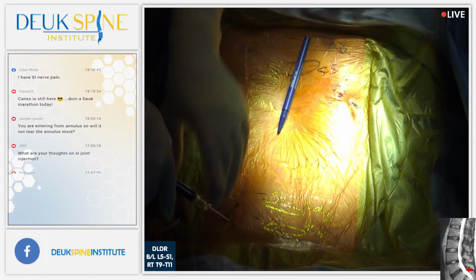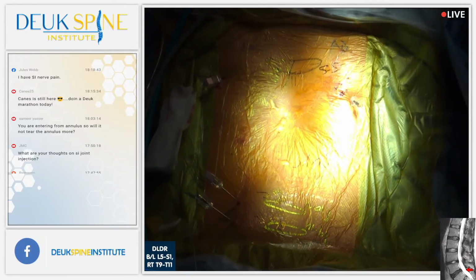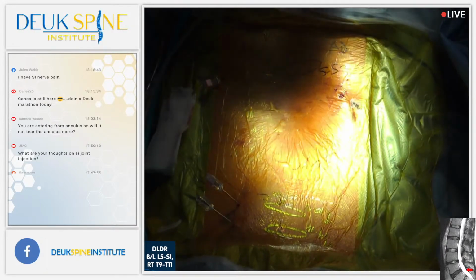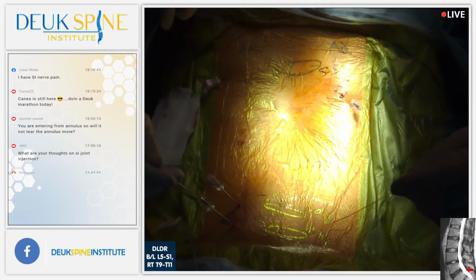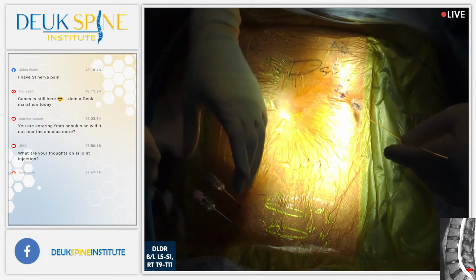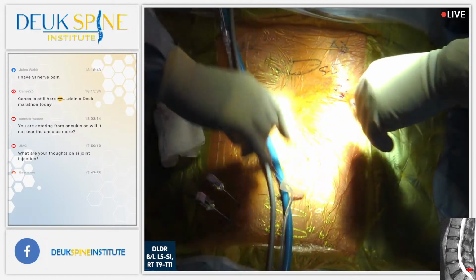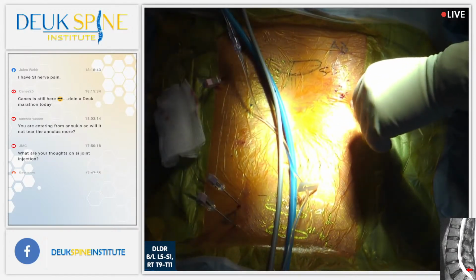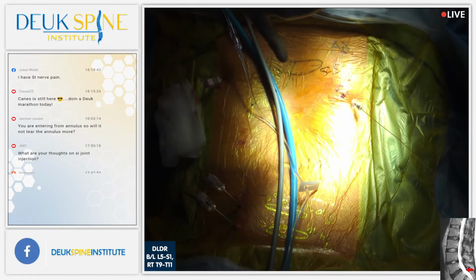Yeah, we're good. All right, where do you want to start, Luis? You got those numbers? So L5-S1 is 11 over 10 concordant. T10-11 is 10 over 10, and T9-10 is 8 over 10. All right, Henry, you're welcome to ask some questions. You can fire the laser, and let's get some pictures at L5-S1.